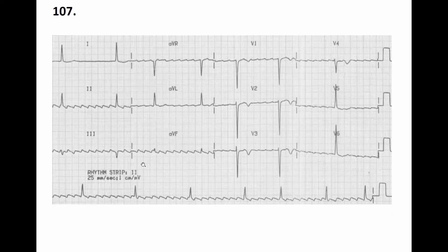Can I ask a question? Yes? And I'm sorry if it was part of the introduction. What is the clinical meaning if the flutter is rhythmic or not rhythmic?